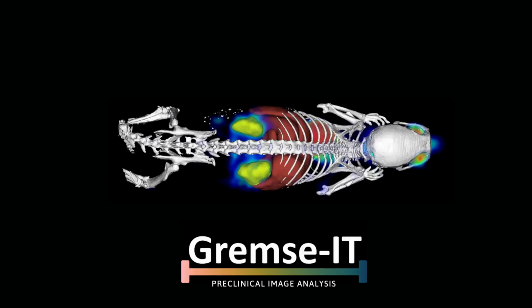Hello, welcome to this tutorial video in which I will show you how to customize the graphical user interface, short GUI, settings of the Imalytics Preclinical software to best suit your needs. Let me open the software first.